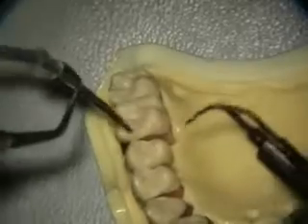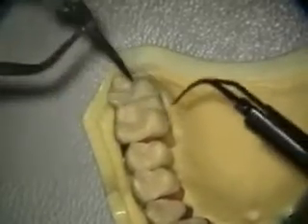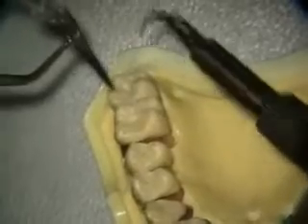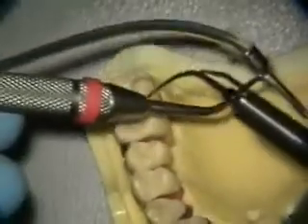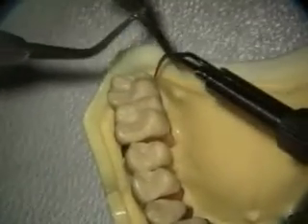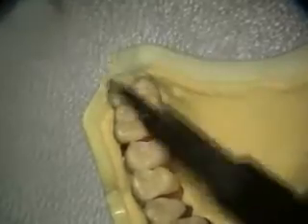So I've reset my instruments and I've reset my patient. I normally have my patient straight up. Again, the saliva ejector's back here. I've changed to the red or the right viewing explorer, and I changed back to the straight ultrasonic.